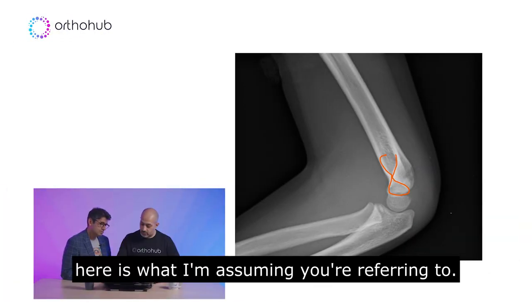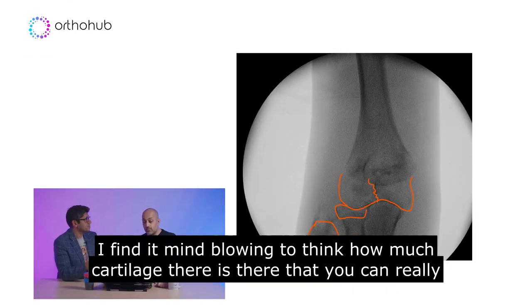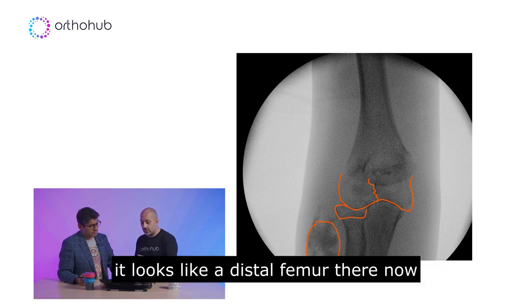This thing here is what I'm assuming you're referring to. I quite like that figure of eight, actually. I find it mind-blowing to think how much cartilage there is there. You can really under-appreciate on the X-rays how much is going on there — it looks like a distal femur there.